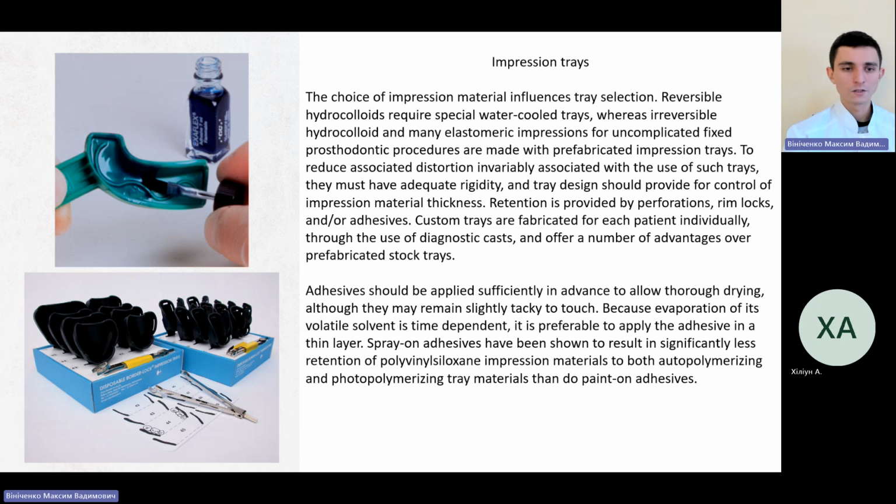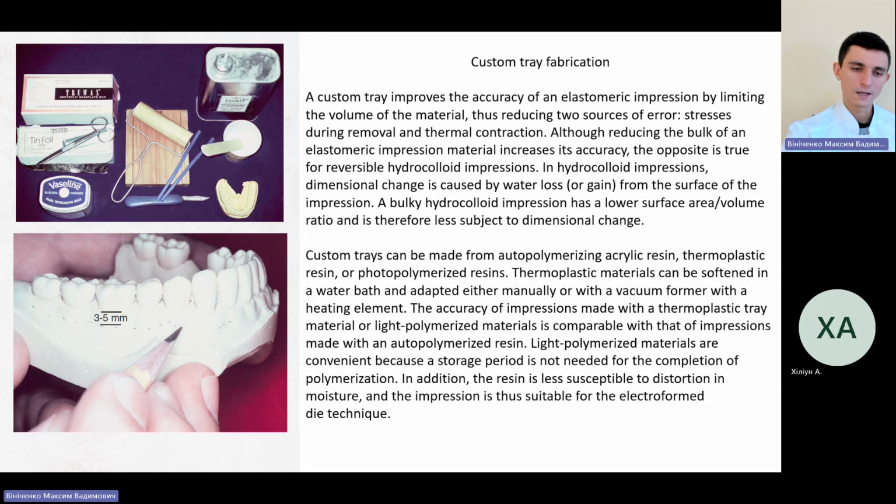Because evaporation of its volatile solvent is time dependent, it is preferable to apply the adhesive in a thin layer. Spray adhesives have been shown to result in significantly less retention of polyvinyl siloxane impression materials to both autopolymerizing and photopolymerizing tray materials than do paint-on adhesives.